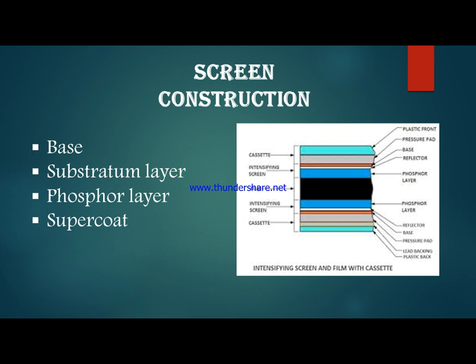This is the screen construction: base, substratum layer, phosphor and supercoat.